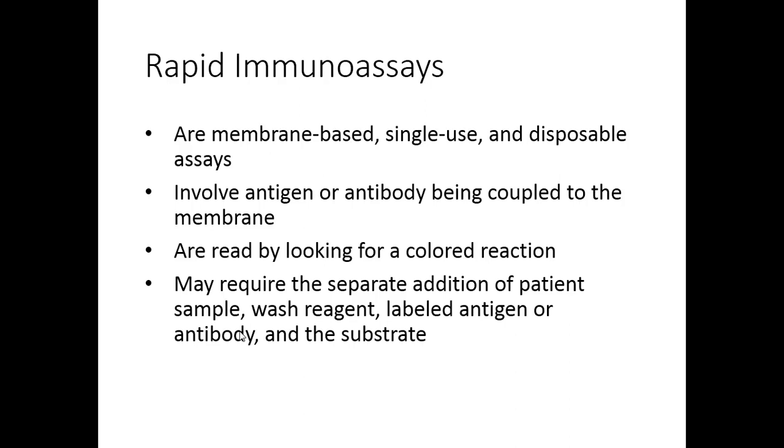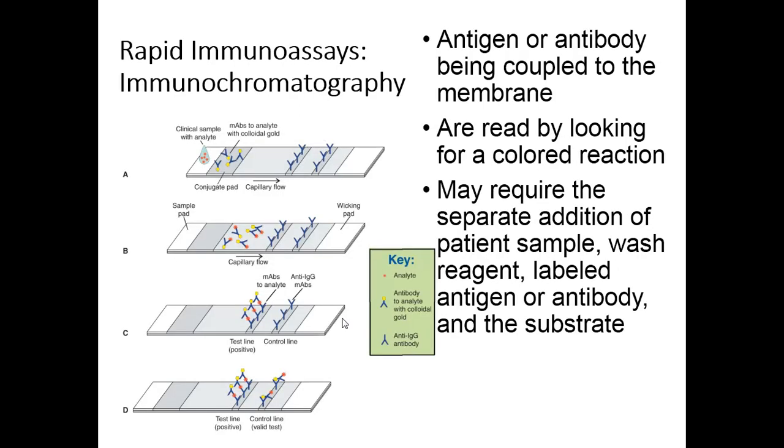There could, in some cases, be separate steps that are needed in this. Addition of patient sample, washing reagent, labeled antigen. We might have some wash steps. All sorts of things can happen. But let's look at an example, and I think we'll walk through it, and it'll make a lot of sense.